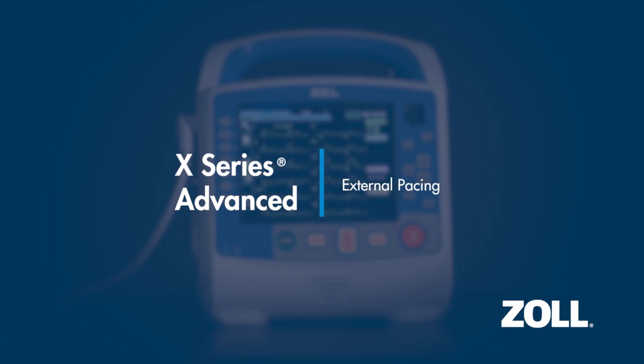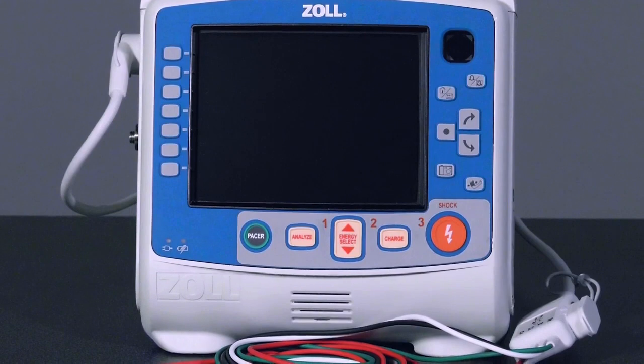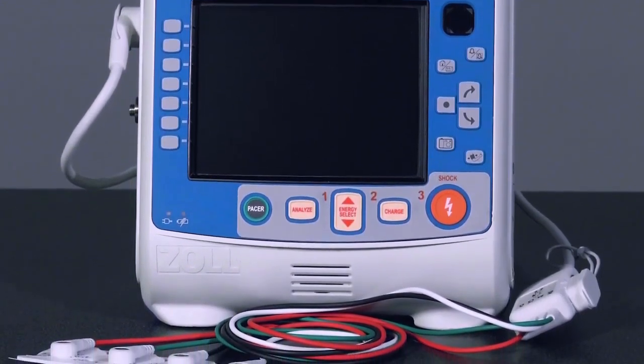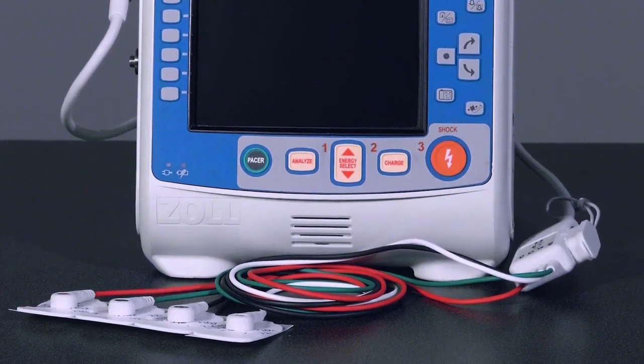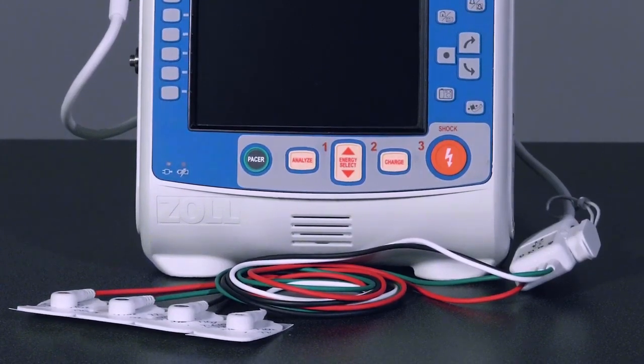External pacing. To initiate transcutaneous pacing, both the 4-lead ECG cable and Zoll ECG electrodes need to be applied to the patient.